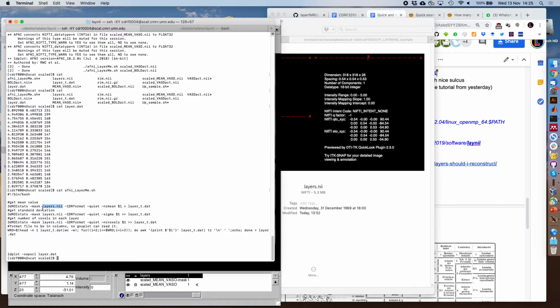But of course, if you upsample before, then you don't have all these resolution losses that Jonathan talked about, these resampling issues. Upsampling in k-space also answers the question of which interpolation function to use. You cannot really lose anything if you upsample in k-space, because that's all the data you acquired. You're not putting any features there that weren't acquired.